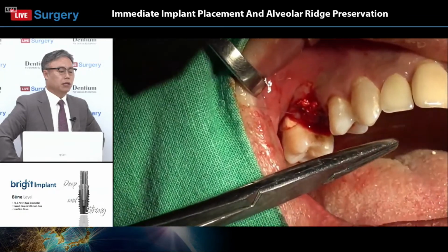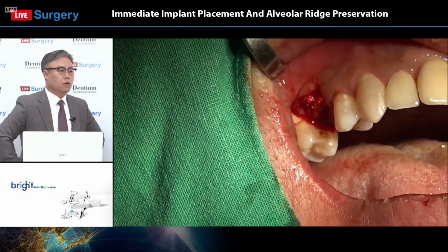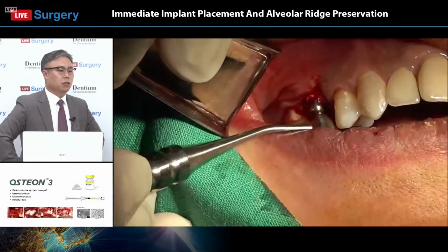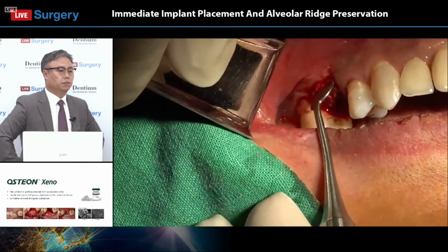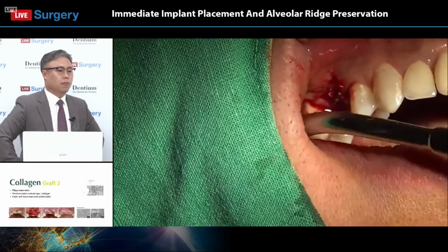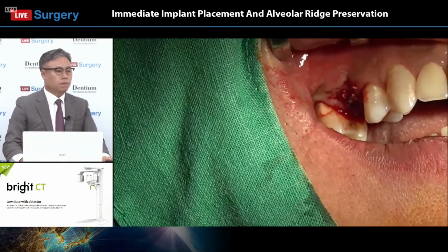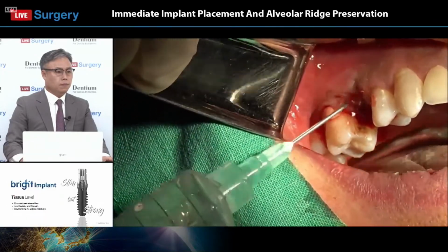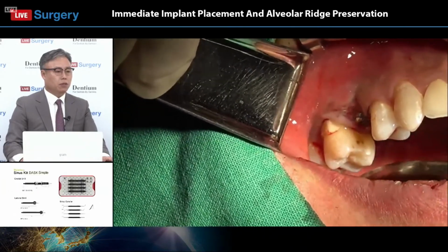But the flap on the buccal side and the palatal side should be closed after the suture, close to each other, I mean. Yeah, we can also remove the remnant. It's a good way to remove the remnant of the bone graft material with saline irrigation.